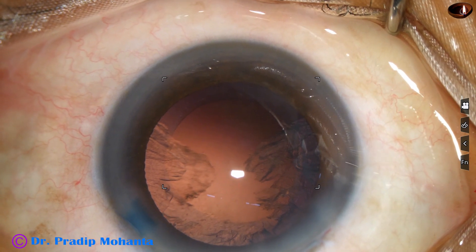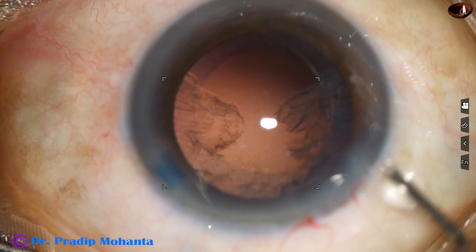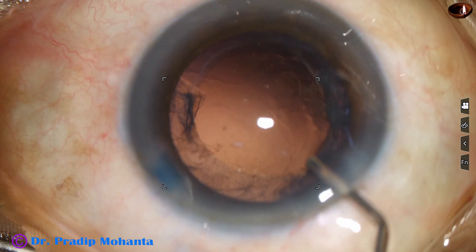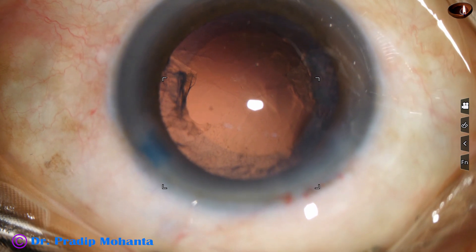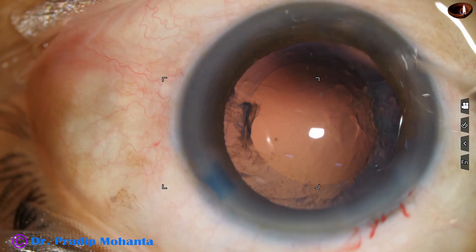The posterior capsule is intact. The chamber was very stable all the time, and there is no up-and-down movement of the posterior capsule in this case. That means the zonule was okay.